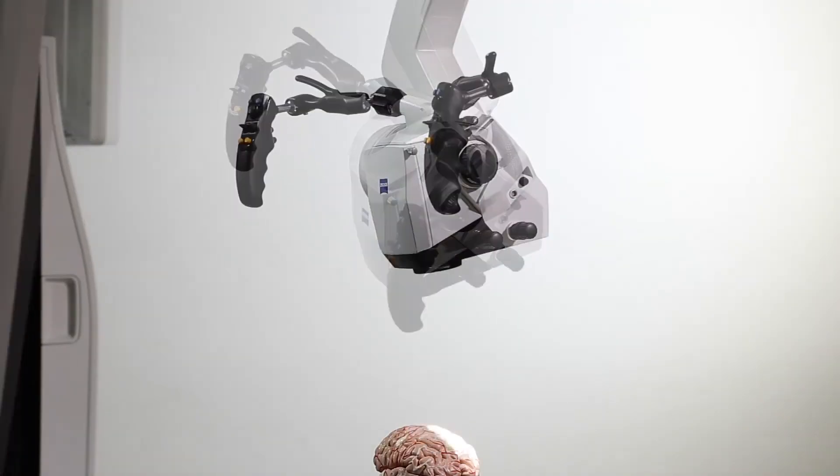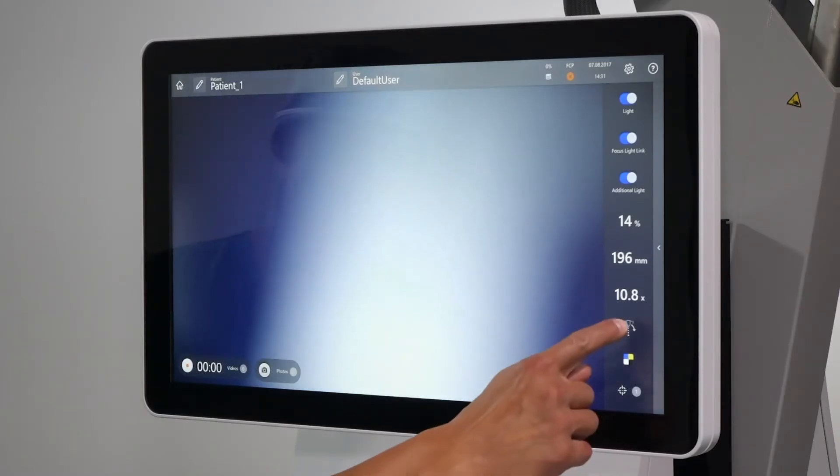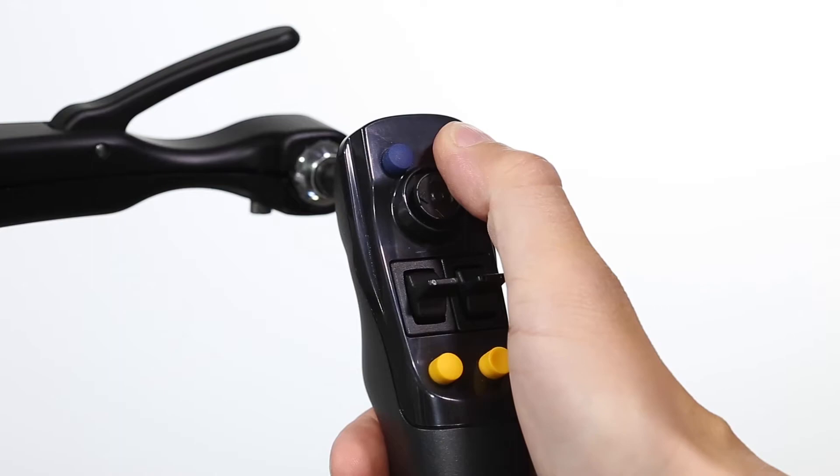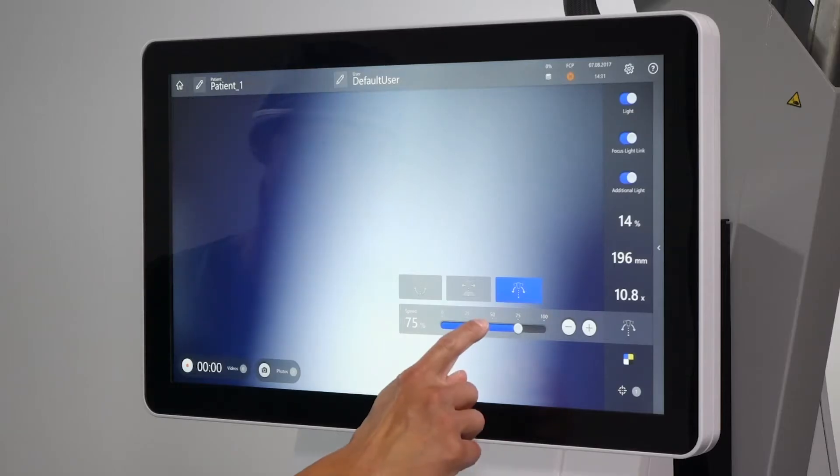The surgeon-controlled robotics of Zeiss Kinevo 900 enables several motorized movement modes. These can be activated via the user interface, handgrip, or foot control panel. Speeds can be adjusted in line with the movement mode.